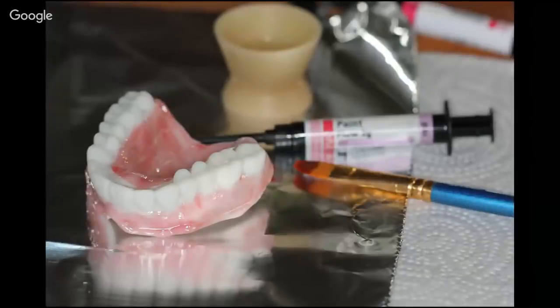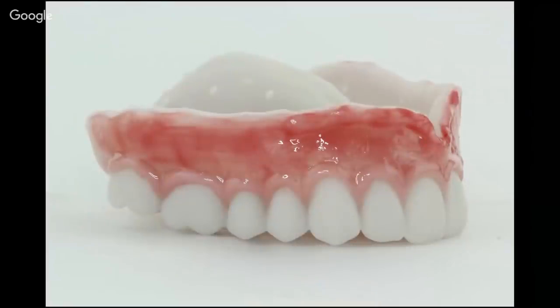And so what I did from there is went back and used the Anax Dent materials. I used the red to basically paint everything and block it out. So a thin wash of the red gingival material gave it its overall pink color. And then I go back, and do you see the gingival roll I'm developing there? This was using the Anax Dent dark pink flow.